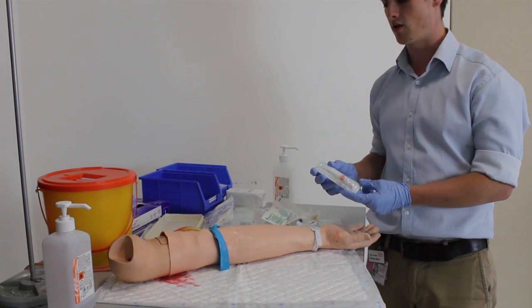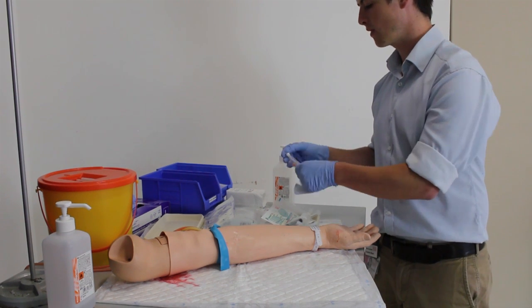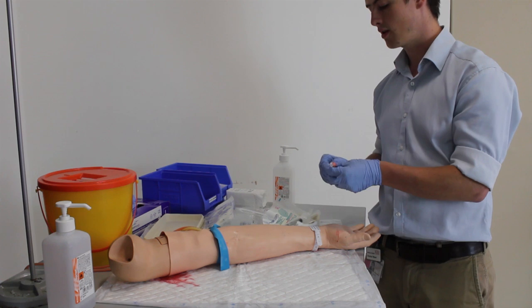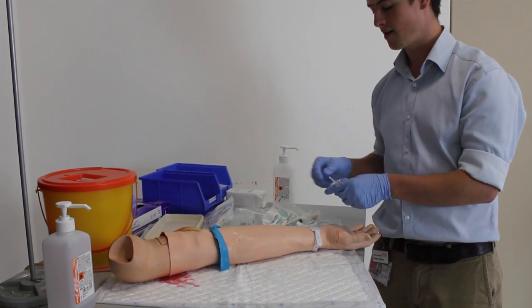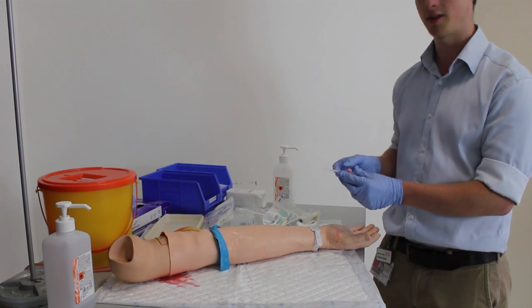During this time you can get your cannula ready. Open up the pack — if you remove the white bung you'll need that later, so just put that to one side — and then fold out the wings of the cannula as well, which helps to fix it down once it's attached.